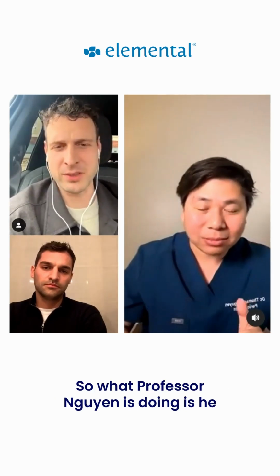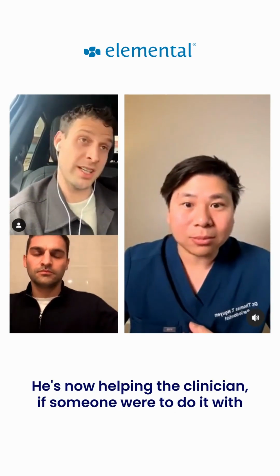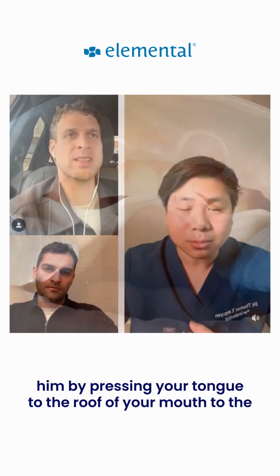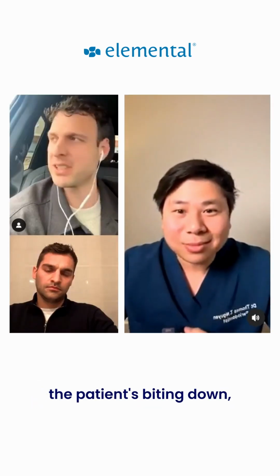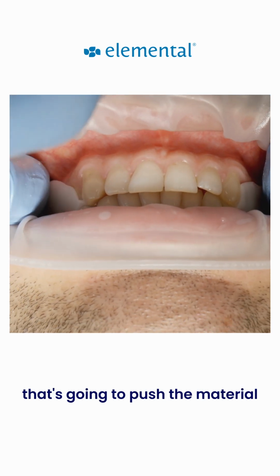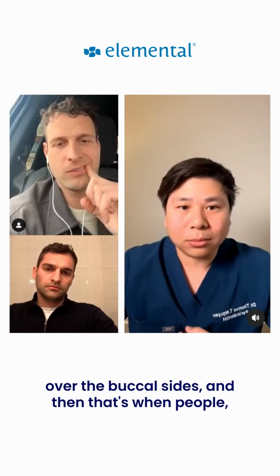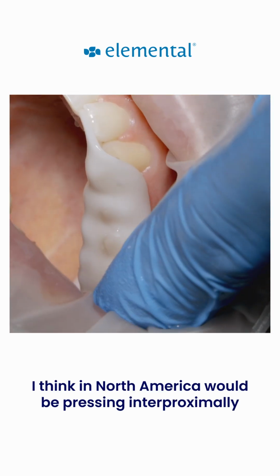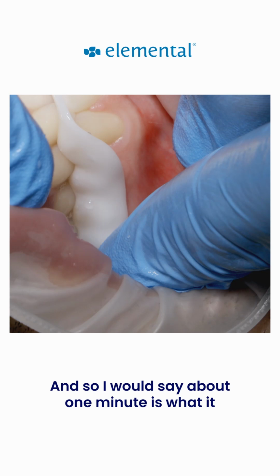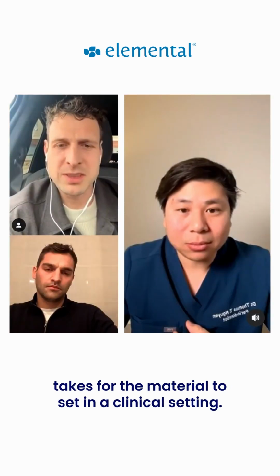So what Professor Nguyen is doing is he placed it to the palate. He's now helping the clinician, if someone were to do it with him, by pressing your tongue to the roof of your mouth, to the palate. And at the same time, the patient's biting down. That's going to push the material over the buccal sides. And then that's when people, probably the assistant, I think, in North America, would be pressing interproximally to get extra tension. And so I would say about 1 minute is what it takes for the material to set.